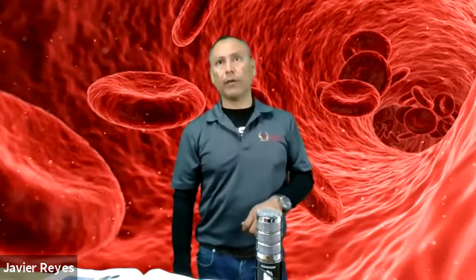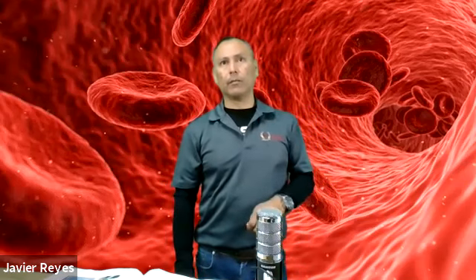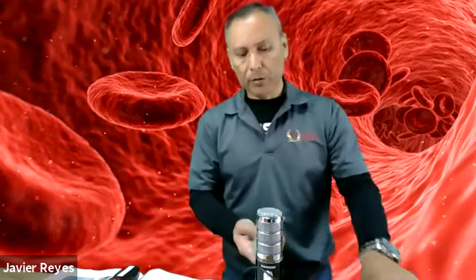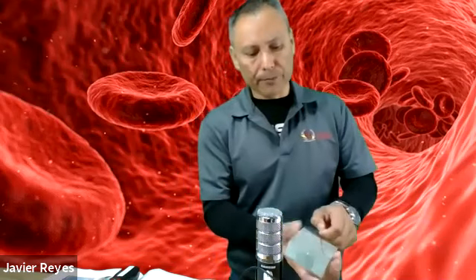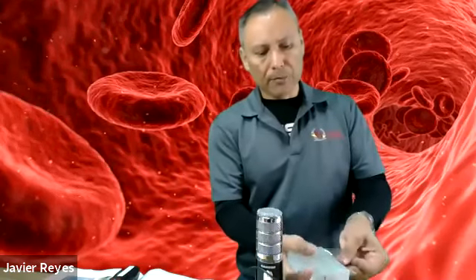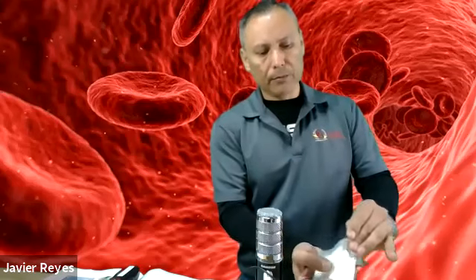Touch the collection tube or device to the drop of blood. This is when you're going to collect the peripheral smear. You're going to be grabbing the slide and making very little contact with the slide. The drop of blood will go on your slide.